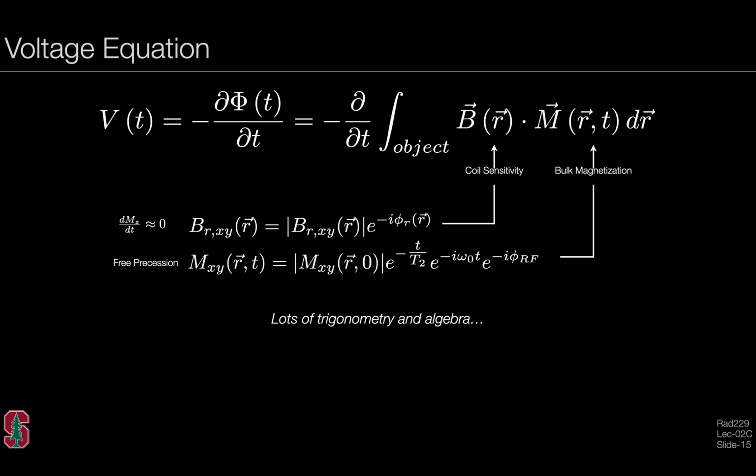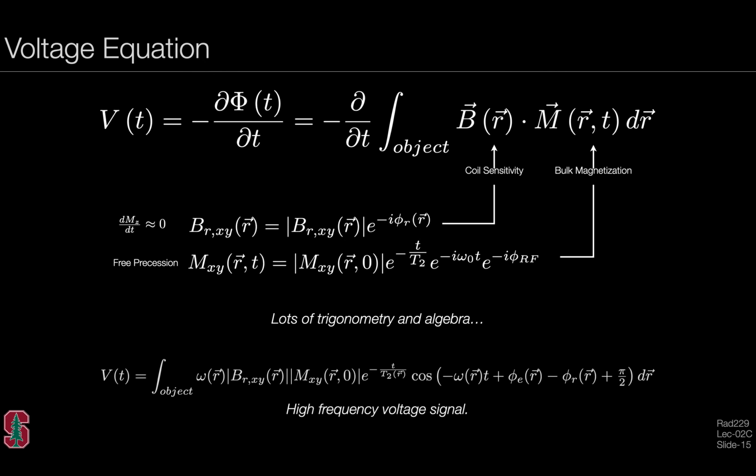There's a lot of trigonometry, there's a lot of algebra that comes in between until we finally have a high frequency voltage signal. And so this high frequency voltage signal has a lot of important components to it, and it's good to be able to identify what the individual components imply or infer. Not important to memorize this expression.